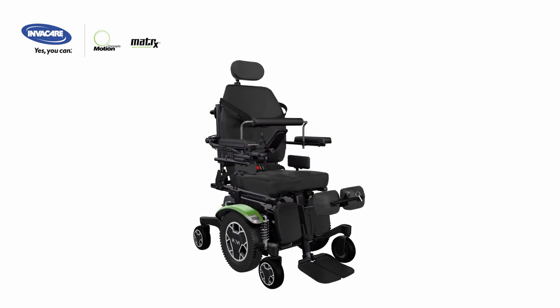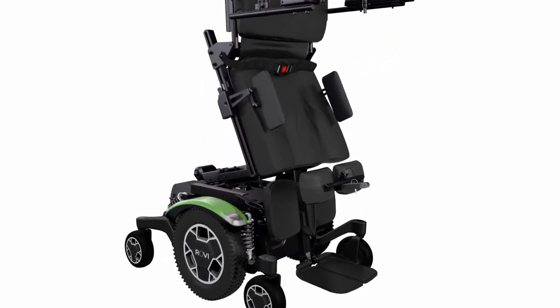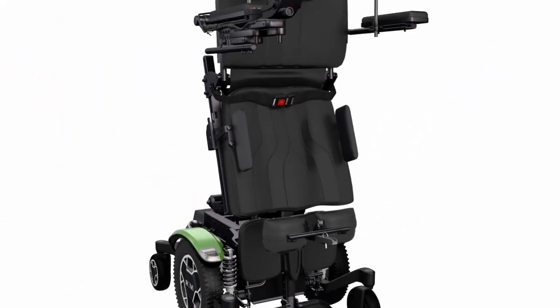The removable knee block stores conveniently on a retractable bracket when not in use. For added stability and safety, the anti-drive locking mechanism locks the front suspension arms as the standing function is engaged.